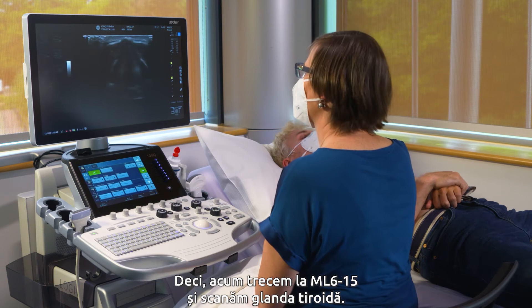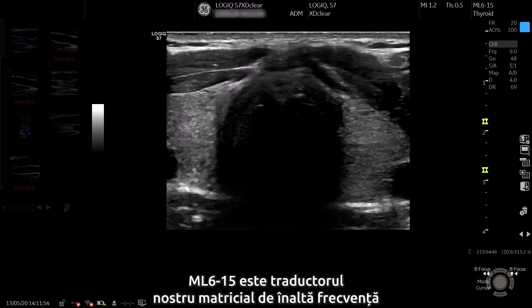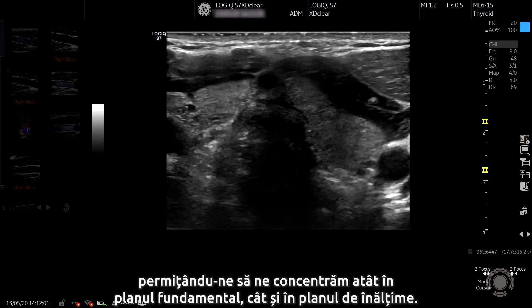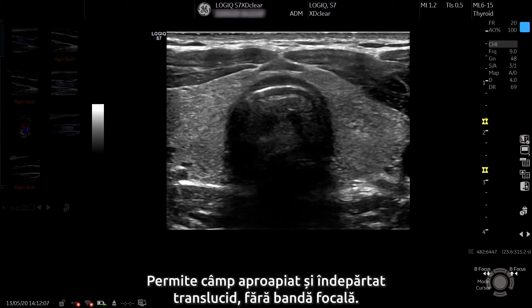Now let's move to the ML6-15 and scan the thyroid gland. The ML6-15 is our high frequency matrix array transducer with rows and columns of crystals, allowing us to focus in both the fundamental plane as well as the elevational plane, thus allowing near to far field resolution with no focal banding.